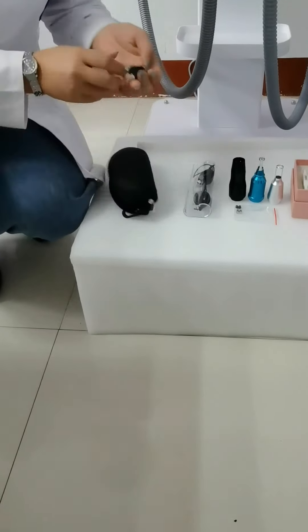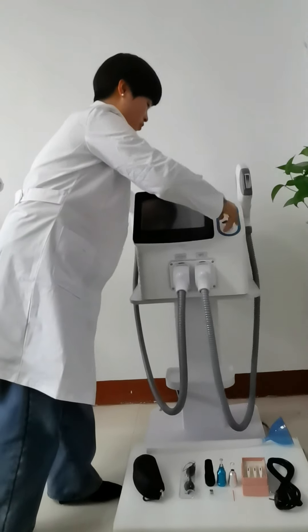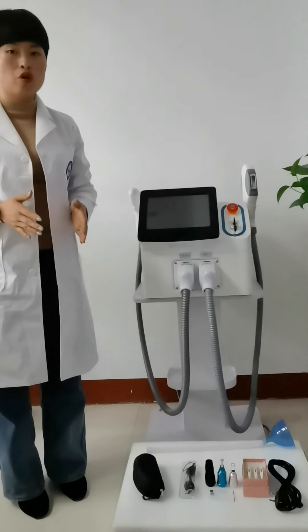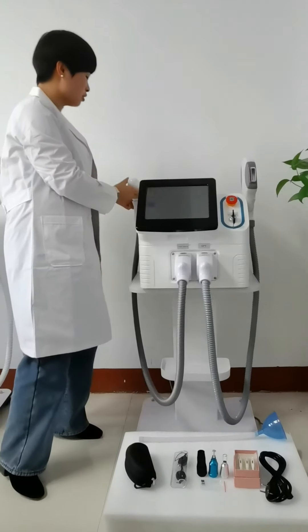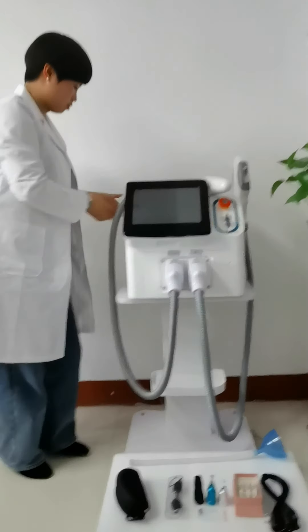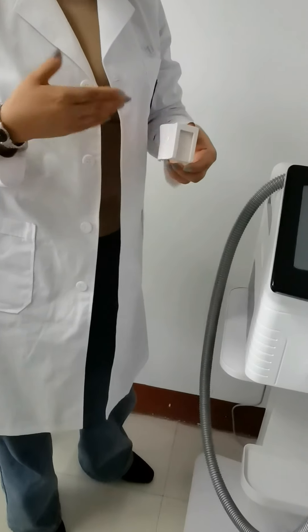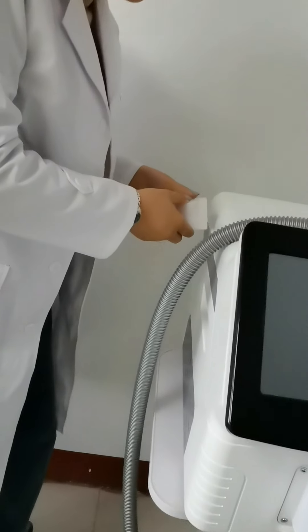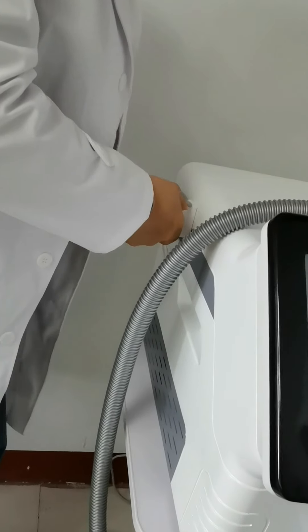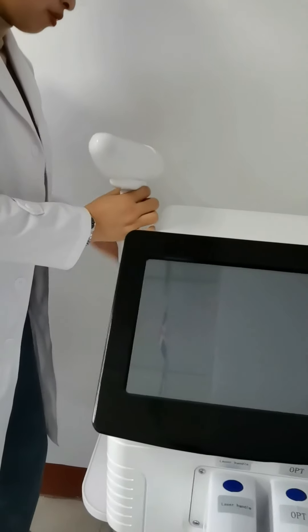Before you use this machine, we have four steps to go through. First, you need to install the handle holder. The handle holder is very easy. You can see the handle holder is like this — what you need to do is just put it like this. Now the handle is on. The two sides are the same way. When you install the handle holder, you can put the handle like this.